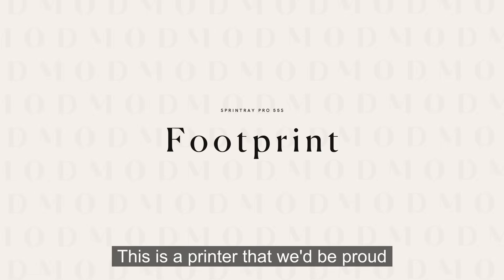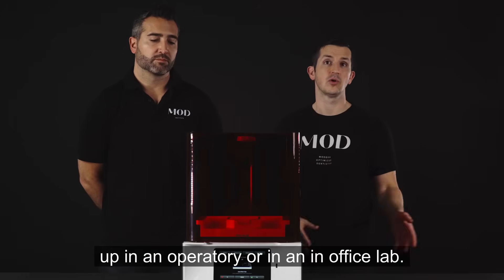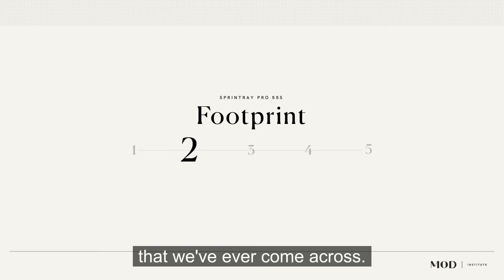This is a printer that we'd be proud to display in a dental office. It was clearly designed to have a manageable footprint that could be set up in an operatory or in an in-office lab. It's definitely one of the better looking, more well-designed printers that we've ever come across. We're going to have to rank it a four out of five on footprint.